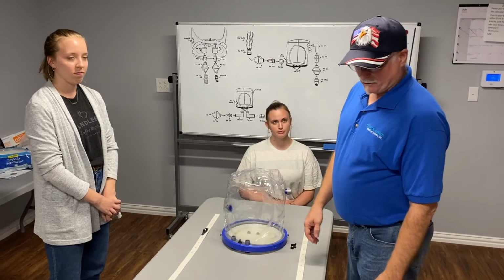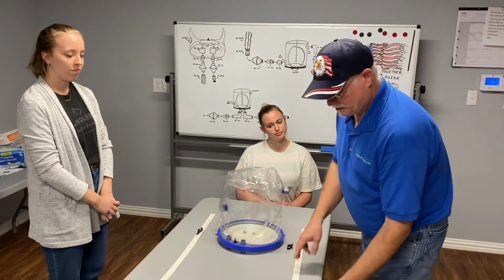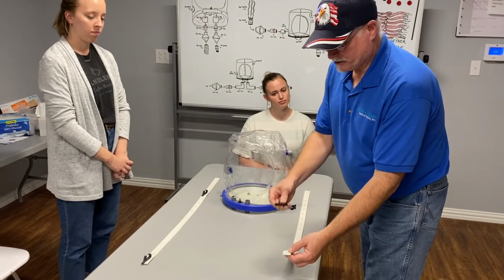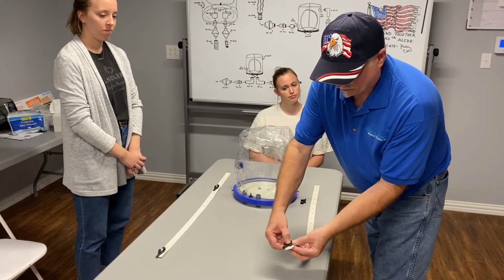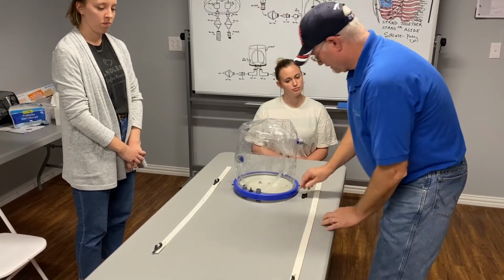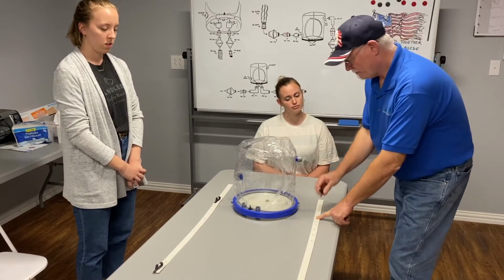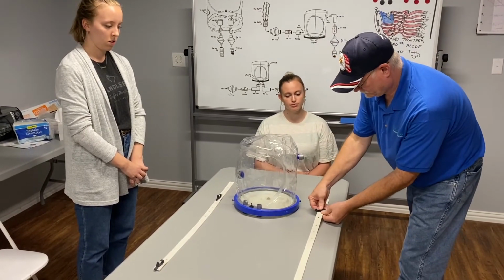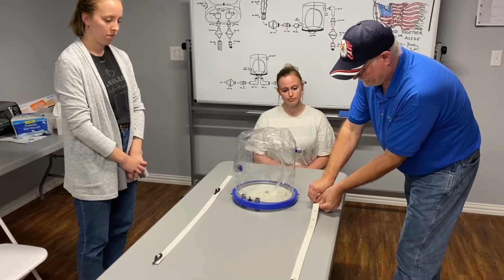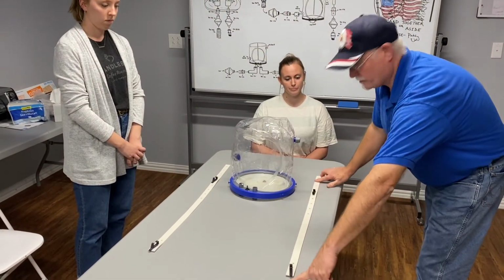Now we're going to show you how to assemble the hood straps and the included clips. It's best to start with giving yourself some range to adjust it for the patient's comfort. You put this on just like a button on a shirt. You roll it in like that. It's in, just that easy. Somewhere in the middle. It's not really critical, but you want to make sure that both of them are in the same hole. Not a problem. Just do it again. You want the clips pointing outward in opposite directions.